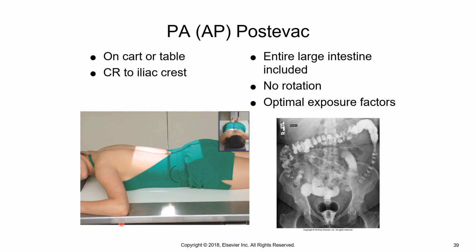You would drop the enema bag to the floor, and you would unclamp the bag so that gravity would help draw the barium out of the patient back into the bag. So it'll run into the bag for a few minutes, and at some point it will start to trickle and slow down. At that point, you would want to clamp the bag closed.